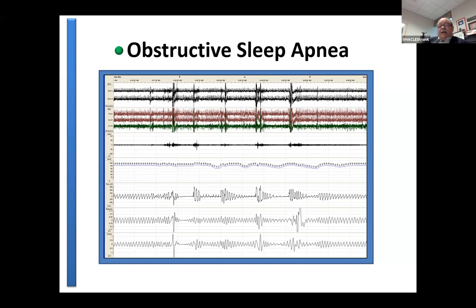And what he would say is that the difference between regular breathing and hypopneas and apneas is a very thin line. And I think you need to start looking at this. If you saw the breathing pattern on the right for the first 10, 15 seconds throughout the entire period of the sleep study, you'd say, oh, this guy's normal. And if you saw it at the end, this guy's normal. But in the middle, all these sorts of things are happening.